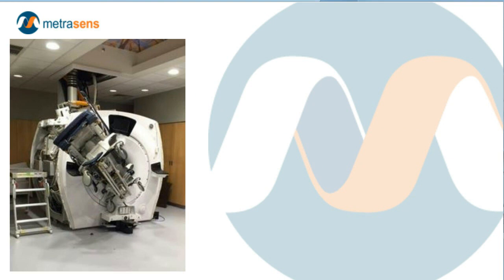So the picture we're looking at right now shows a hospital bed stuck on the face of a magnet, an MRI scanner. This happened at a very prominent academic medical center. So we can't pretend that these accidents only happen at backwater locations. The things that make these accidents happen are pretty ubiquitous throughout healthcare. But what's the designer's role in helping to prevent this accident?